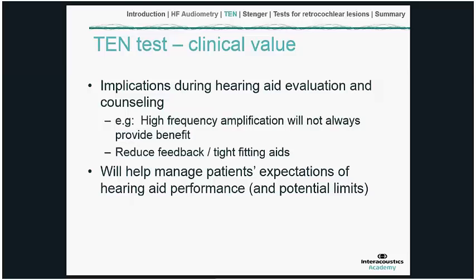It may just be that the detection is distorted due to the on frequency and off frequency listening at the edge frequency. Also, since we're talking about thresholds that are likely to be substantially raised, perhaps severe or even worse, that would ordinarily imply high gain on the hearing aid and a tight-fitting earpiece.